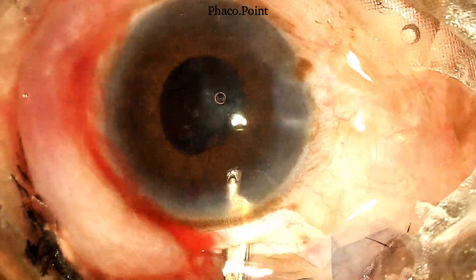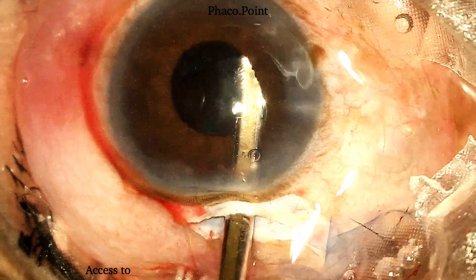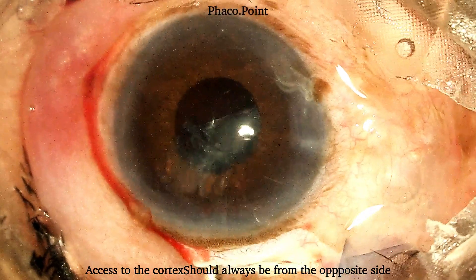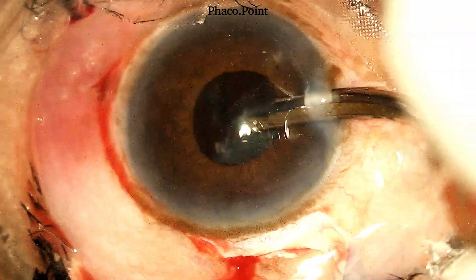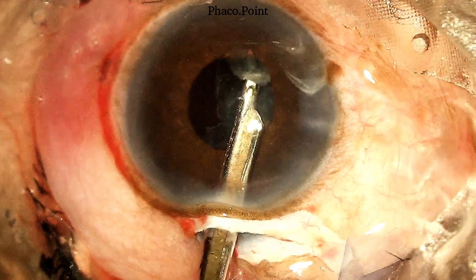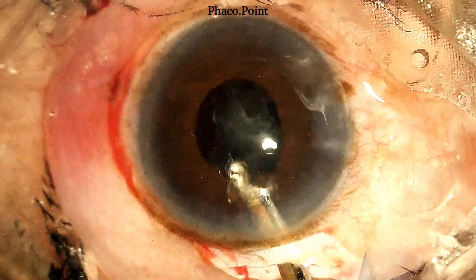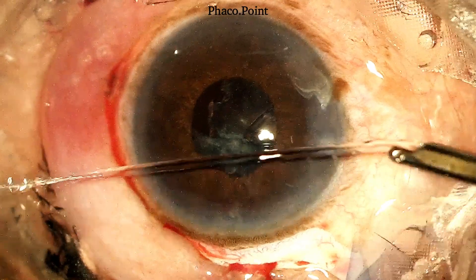Note that when you are aiming to pull out the cortex from one particular quadrant, the access always has to be from the opposite side. Once drawn out from the equator towards the center, the subsequent aspiration of the cortex becomes reasonably easy. In a small pupil, it is important to try and release the cortex from its peripheral attachments, draw it towards the center, after which it can be easily aspirated.